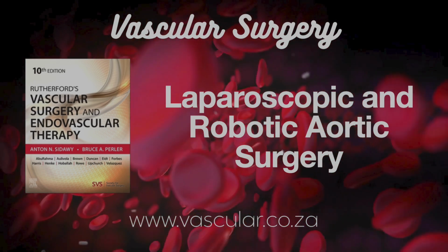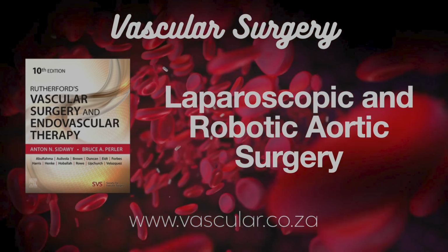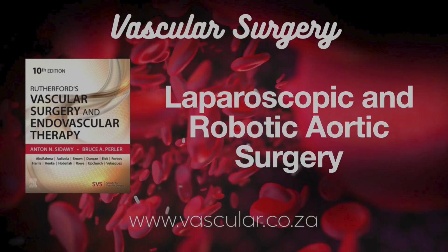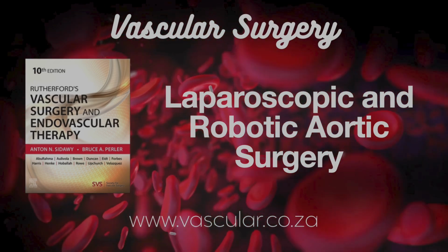Well, they use specialized laparoscopic clamps. They go in through the ports, grab the aorta, and temporarily stop the blood flow. Right, the clamping. Then the sewing part, the anastomosis, usually done with long, strong sutures, polypropylene, often with those little pledgets we mentioned. The reinforcement patches. Exactly, just to buttress the suture line.